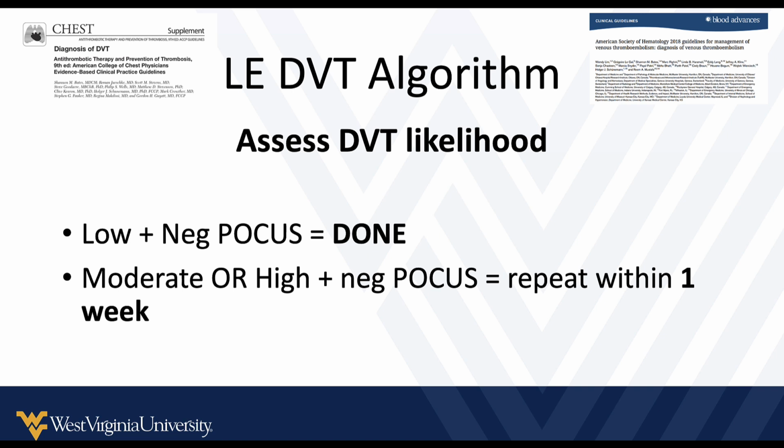If you look at someone's leg and you think, I'm certain they have a DVT, but you don't see it on your bedside ultrasound, and you have concern for a proximal DVT, then think about that other imaging to evaluate the iliac veins in the pelvis.